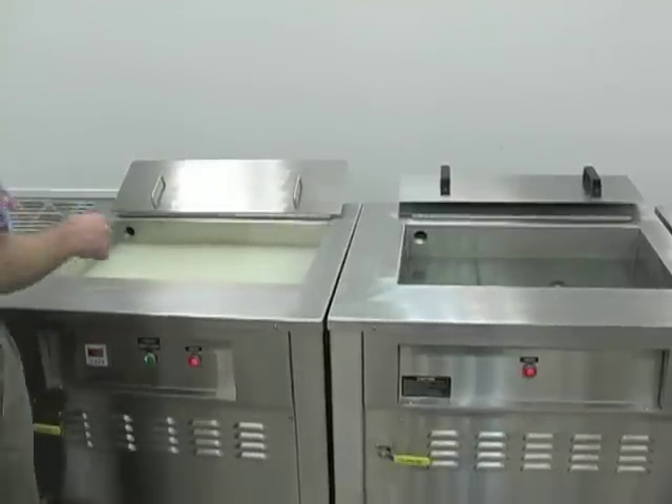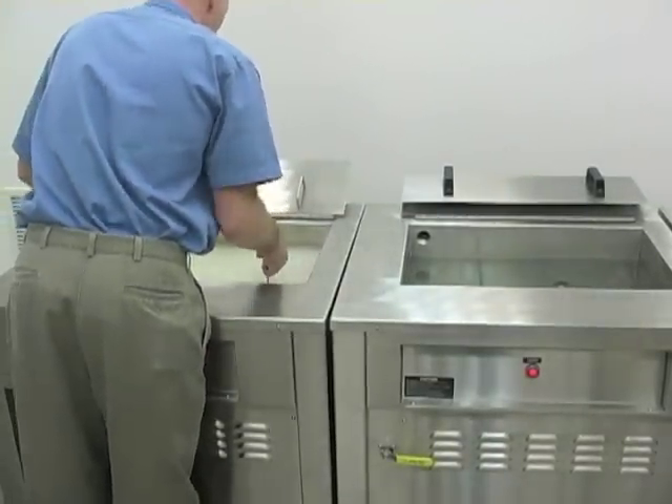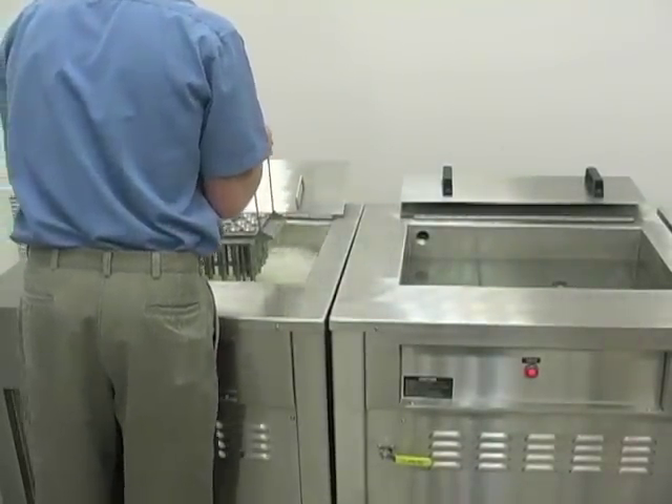The tooling will go straight from the wash unit to the rinse unit.